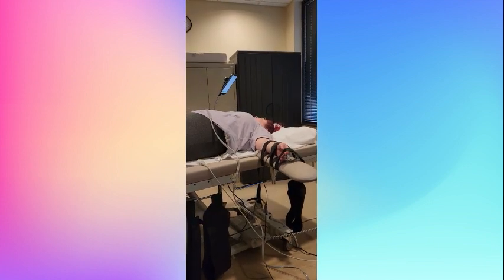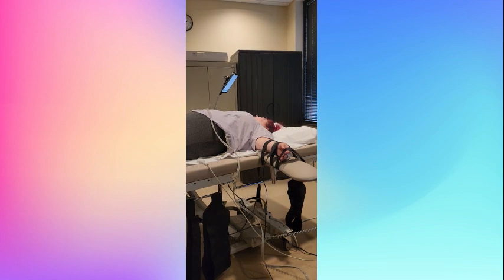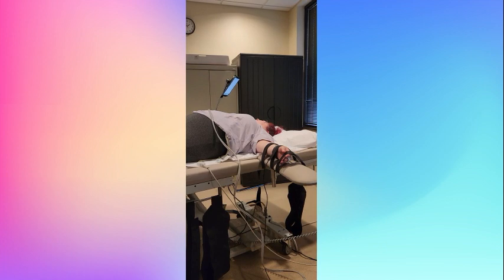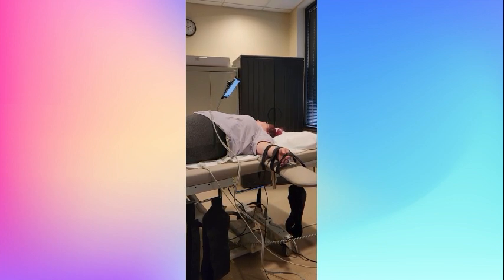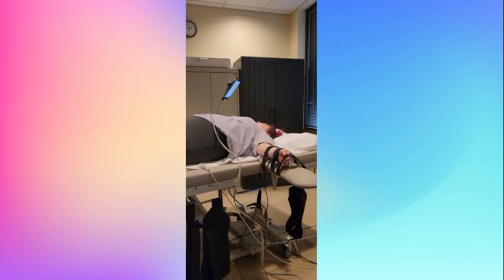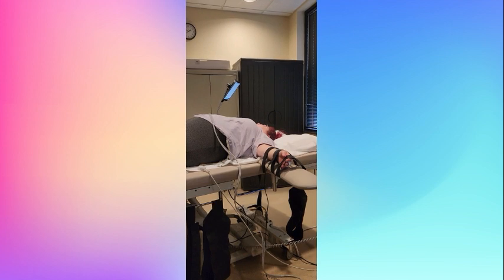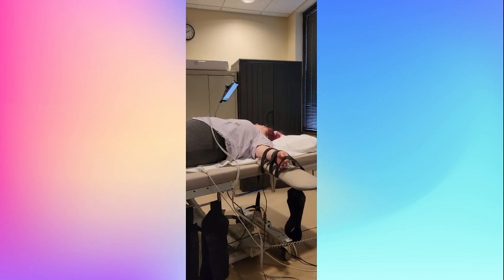While she was describing the tests that were going to be done, she did hook me up to the blood pressure monitor, heart rate monitor, and an EKG throughout all 3 tests. In this part of the video, I'm doing the deep breathing test. I have to breathe slow and deep for 1 minute while my blood pressure and heart rate is recorded. Then I do it all over again.